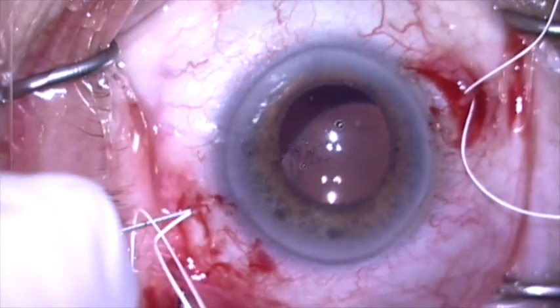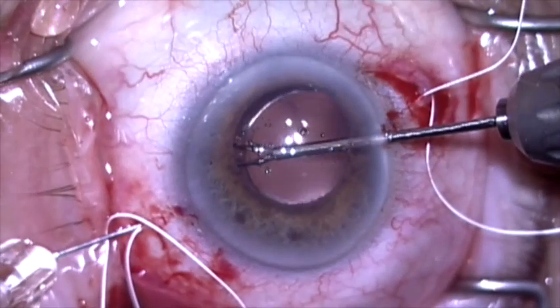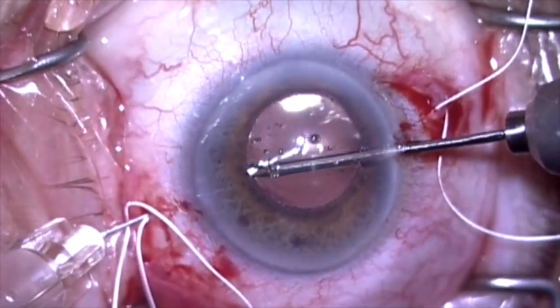The lens is a little decentered, so I'm going to recenter the capsular bag with my right hand using a micrograsper, so that when I puncture through the capsular bag it will center the lens-bag complex.